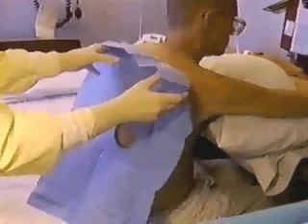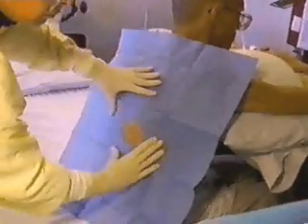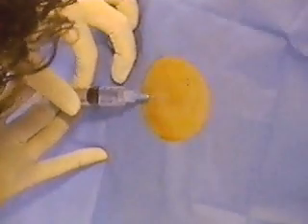She drapes the site using a fenestrated drape supplied with the commercial thoracentesis kit. She anesthetizes the skin, raising a wheal with a small 25-gauge needle.